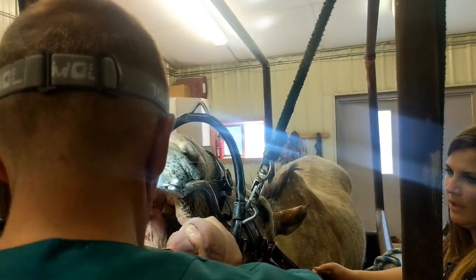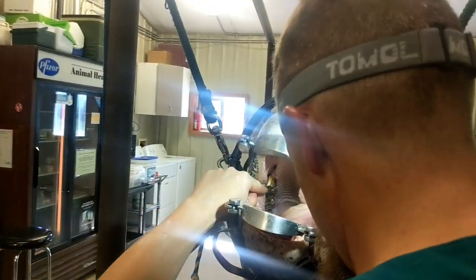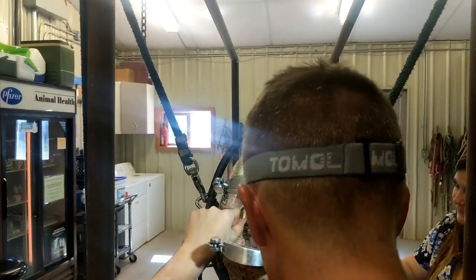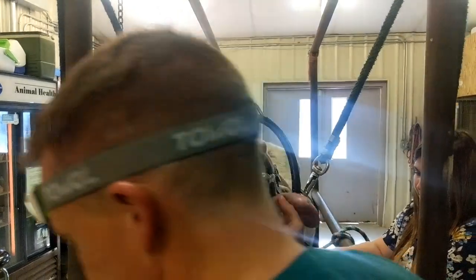Big hooks. Just a typical — yeah, that's a typical old horse. It's not going to surprise us if we find some loose teeth in the process of doing this.